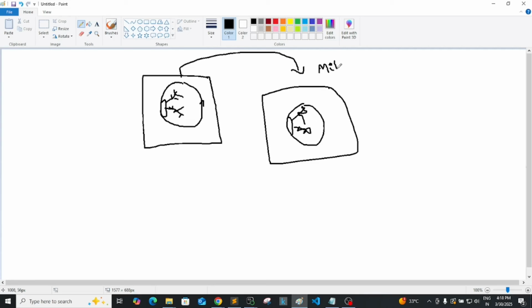Normally, in all the papers, they build the model and implement it. Now I am mentioning explainable AI. If my model says this is mild diabetic retinopathy, explainable AI will show me visually which region was more impactful in saying that this was mild.